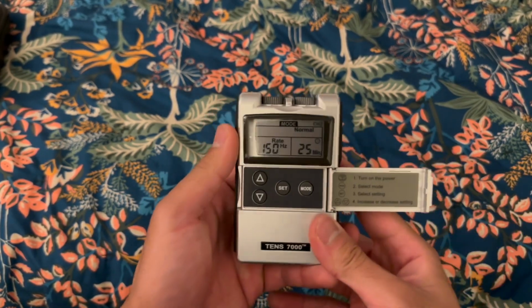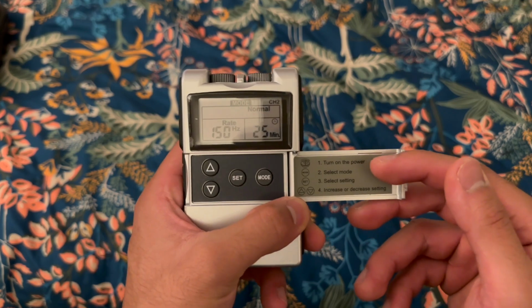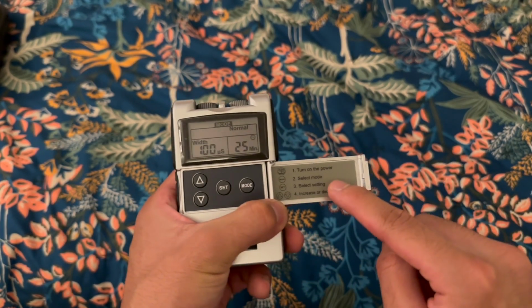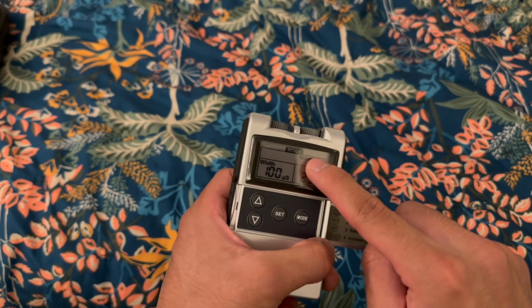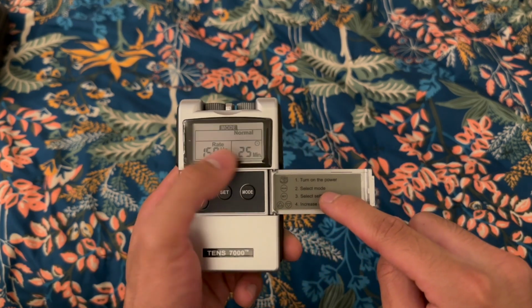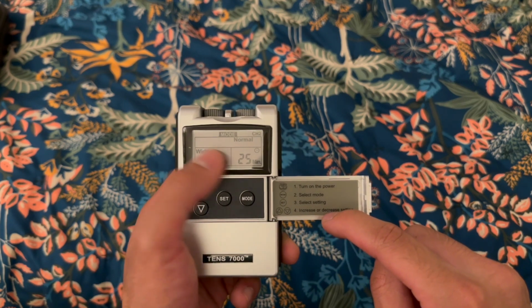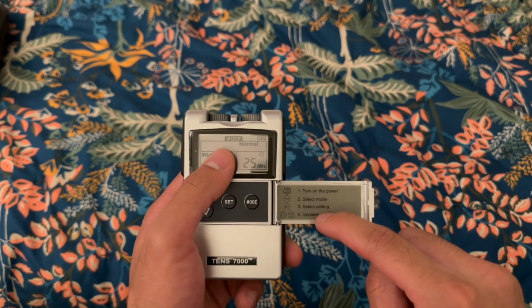We'll lift this cover, and here we can see some brief settings about how we turn the power on with this twist of the knob, selecting different modes up here, selecting different settings to change these numbers and parameters, and then increasing or decreasing the settings once we have the information selected.